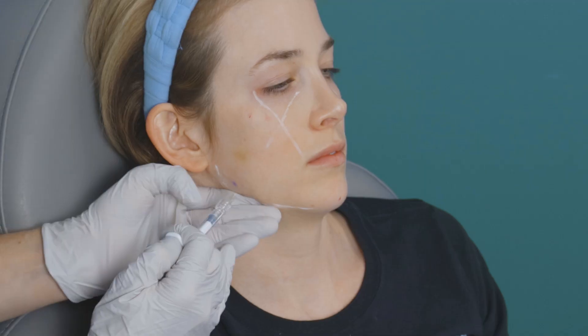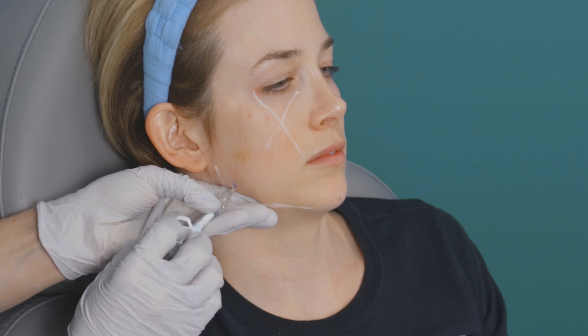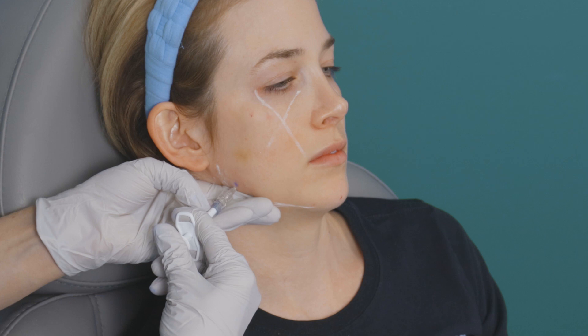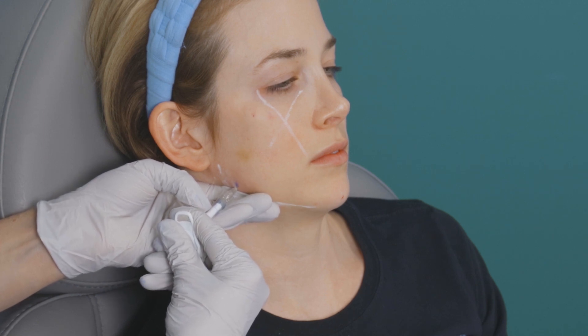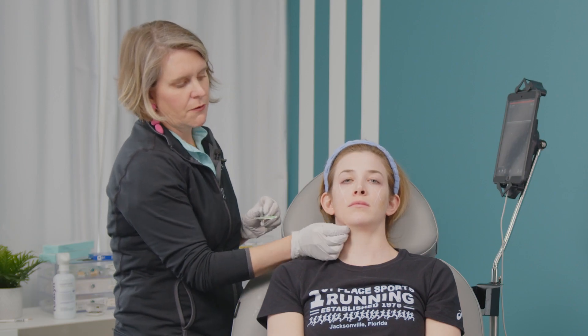Then I hold my chin and remember exactly where I went with my probe — right there. I go right down to bone, and you can aspirate if you want, but it's not necessary because with ultrasound you're able to see what's there. Aspiration is fine — it does predate ultrasound — but now we can just take a look and see what's under there. So I've put my 0.2 bolus back there down to bone. That is a successful bolus and a happy patient with a little bolus to the gonial angle that we've checked for safety. That is safe mapping — hope you enjoyed.